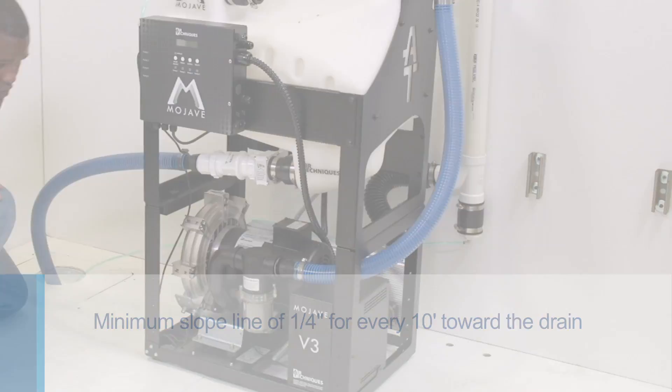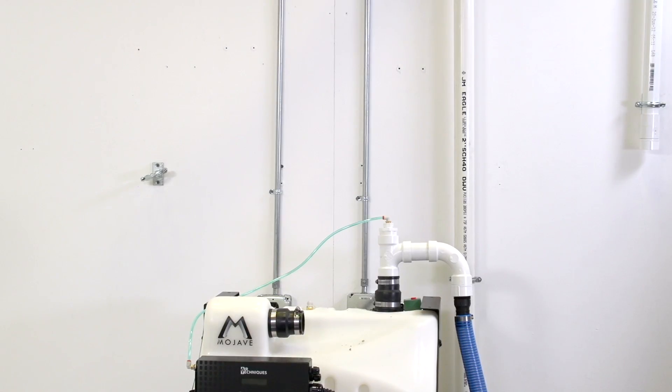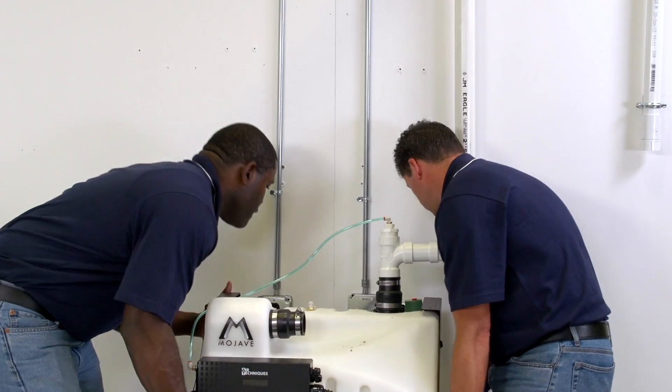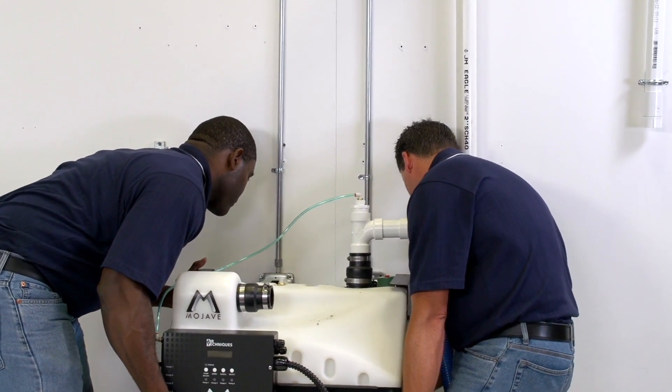Avoid any sharp right angle bends. To ensure that there are no sharp angle bends, it is best to move the Mojave as a team to a more convenient location, and to do so before cutting the final tubing.